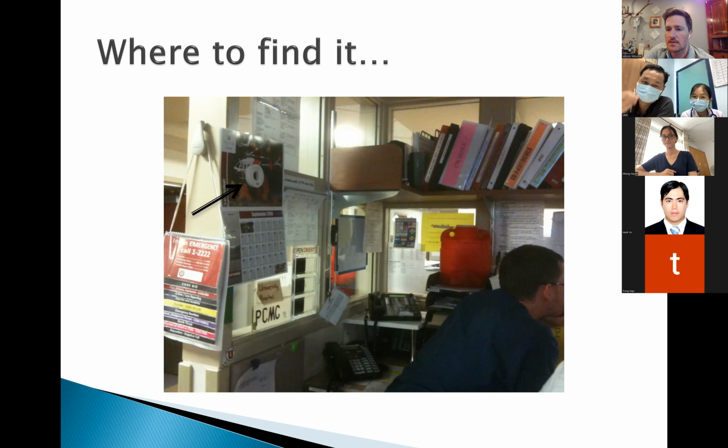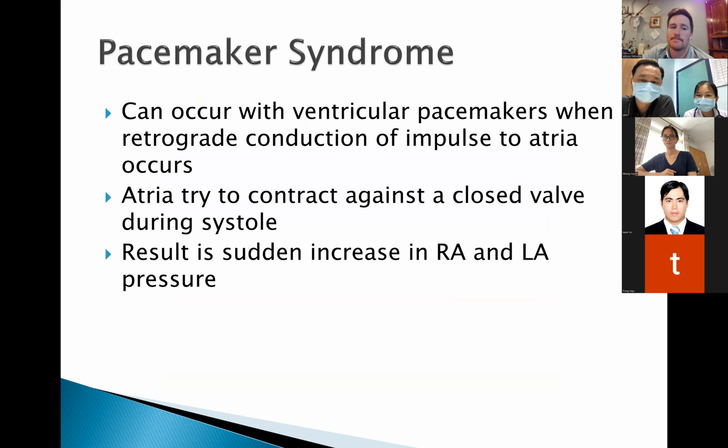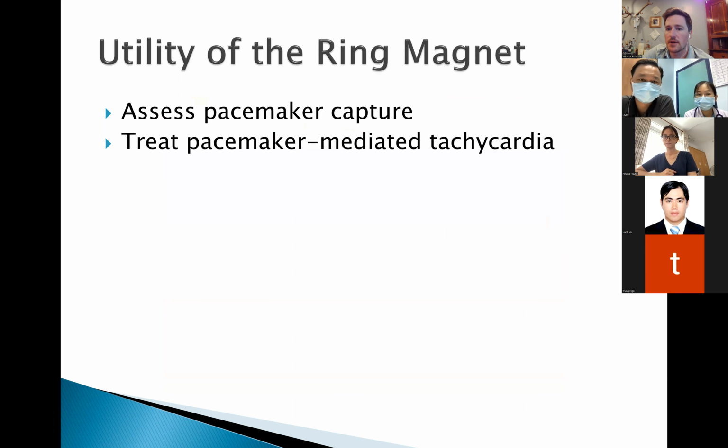If you do have a patient that comes in with this, then the magnet can help treat the patient, along with help with your diagnosis as well. So again, that's just the utility of the ring magnet: assess the pacemaker capture and then treat the pacemaker mediated tachycardia.